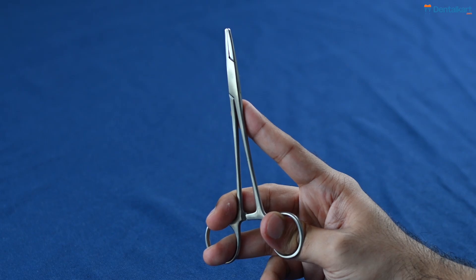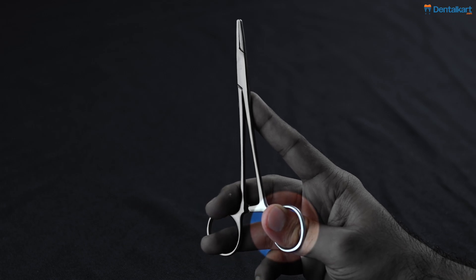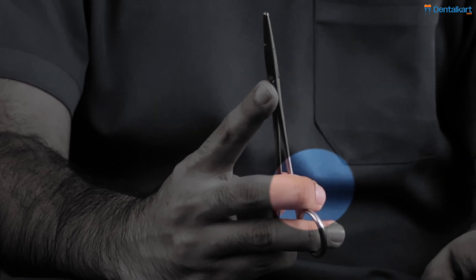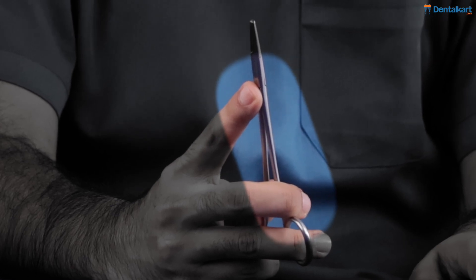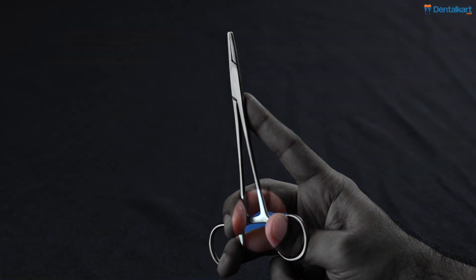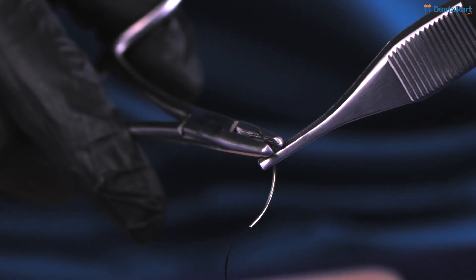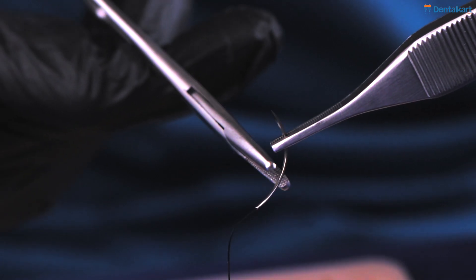This is the right way to hold a needle holder: using your ring finger and your thumb. Your middle finger should be wrapped around the needle holder. The index finger and middle finger should be giving you stability. The needle holder has a double catch lock mechanism, which helps you gain control and stability when you are using the needle.